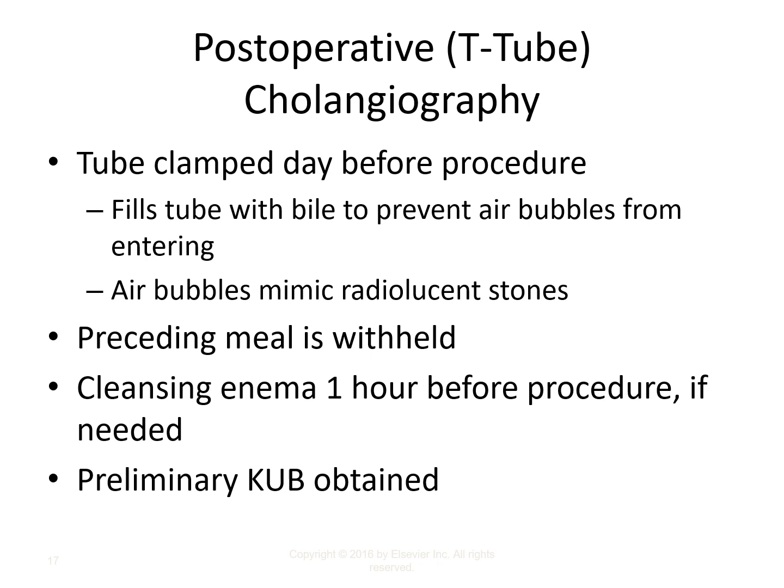Again, we don't want air bubbles because that's a filling defect, and the radiologist will not be able to distinguish between a stone that is a filling defect in the contrast and an air bubble. Okay. Preceding meal is withheld. We want a nice reservoir of bile. Cleansing enema 1 hour before the procedure if needed.